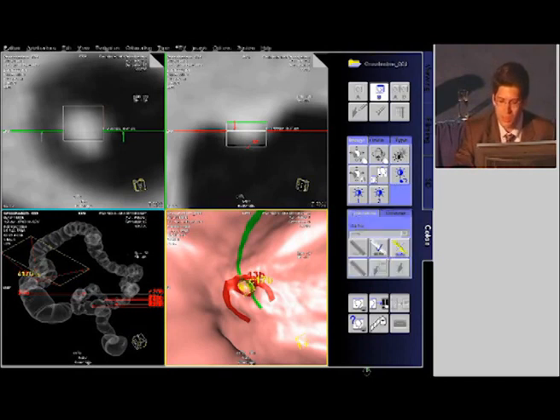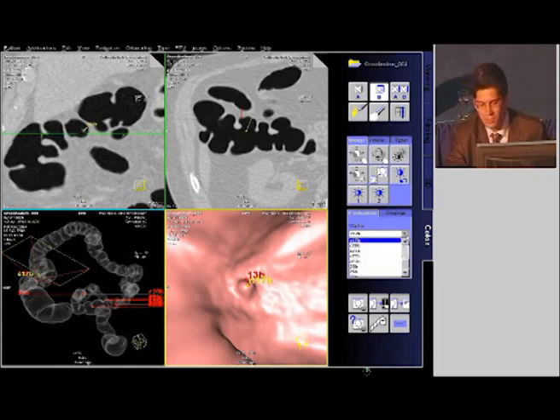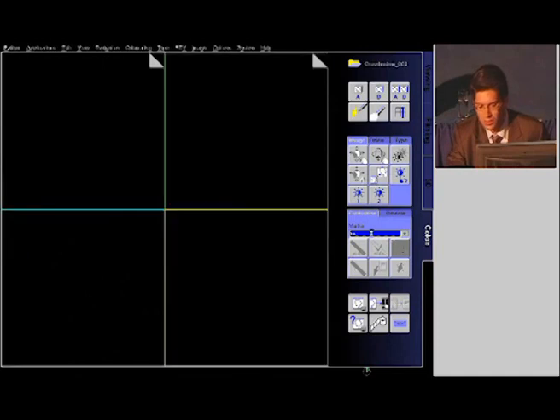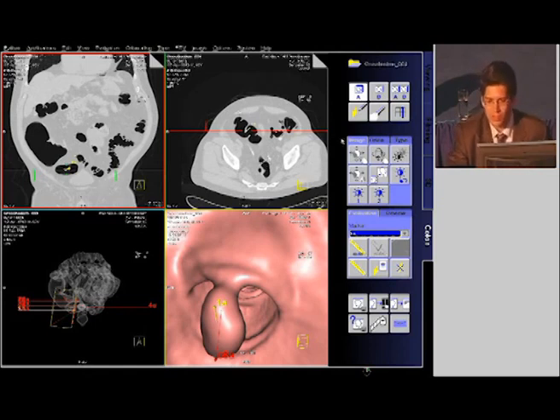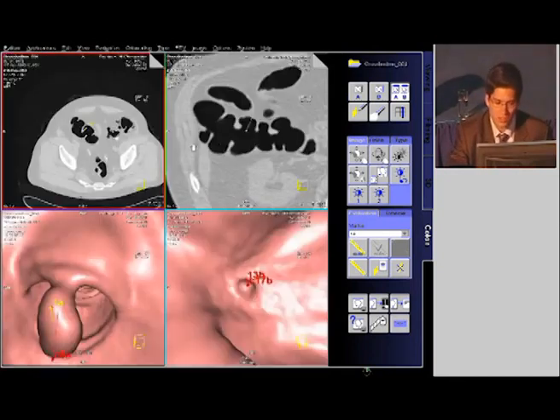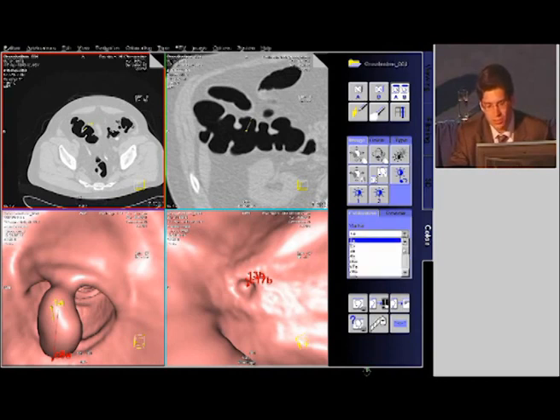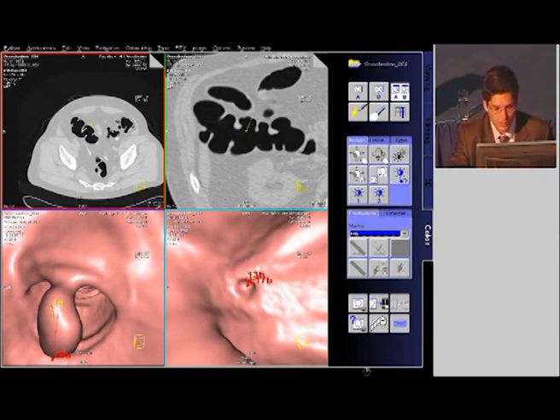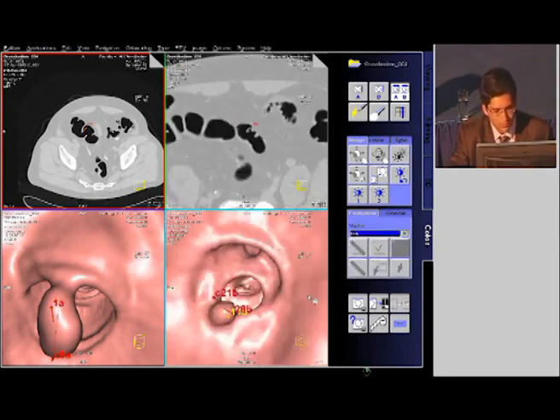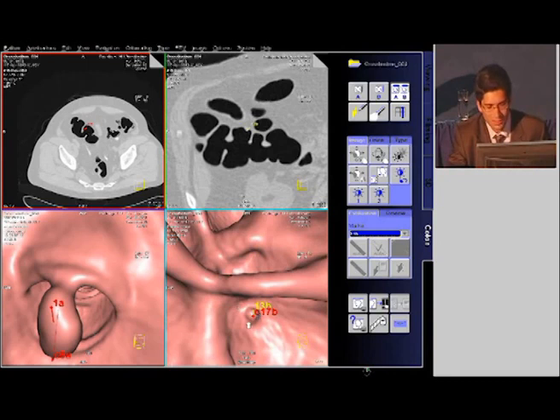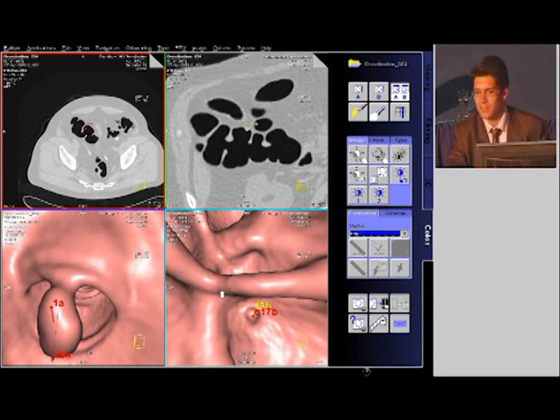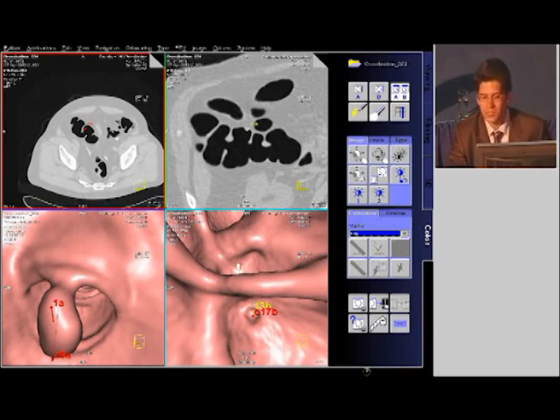Virtual colonoscopy can never be evaluated without looking at both supine and prone data sets. I would do the same for the supine data set. By clicking on the markers I put in before, the system automatically switches to the supine data set, so you can upload both data sets. If you are not sure where a lesion is located, you can display them side by side. You can find communicating lesions which are seen in both projections, and this would make you really confident about what you are seeing. The tool allows you to correlate supine and prone data sets, and all this together with polyp-enhanced view makes you very confident and makes it very easy and feasible to evaluate virtual colonoscopy.